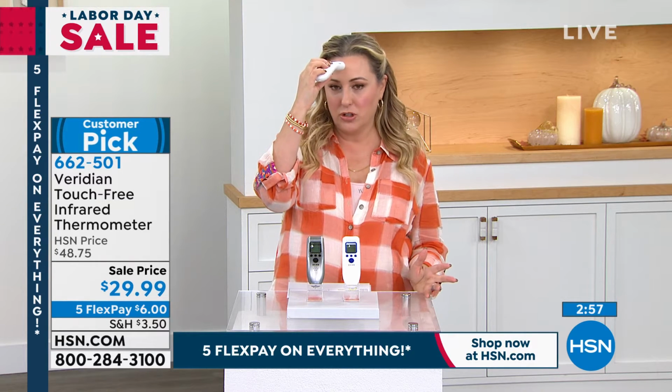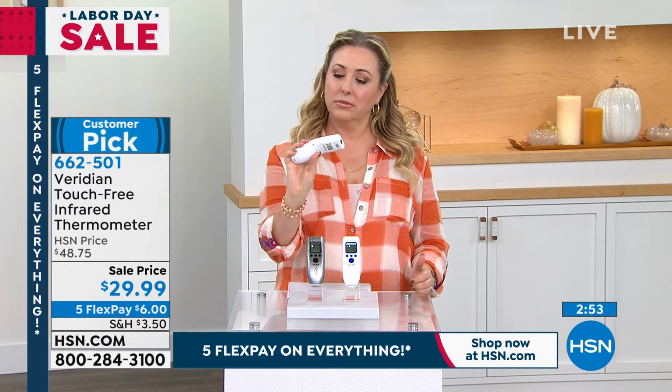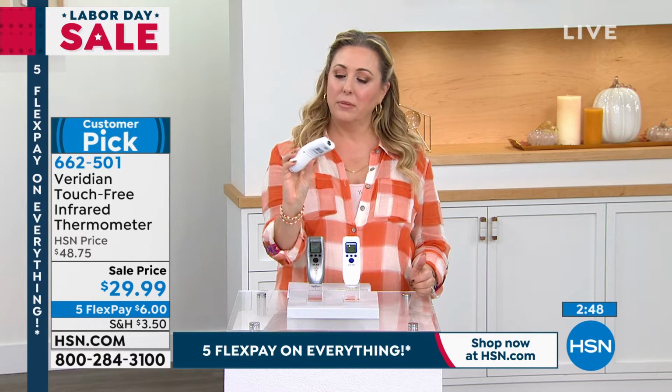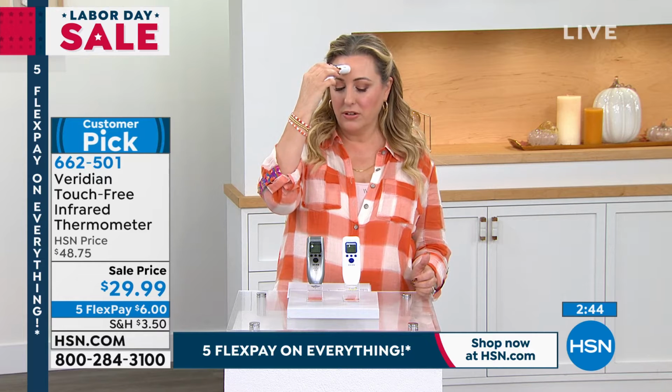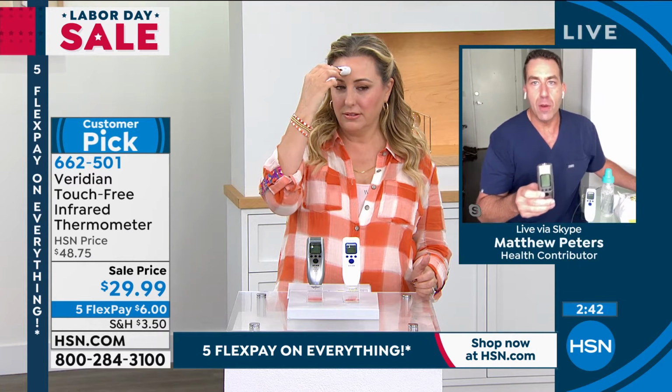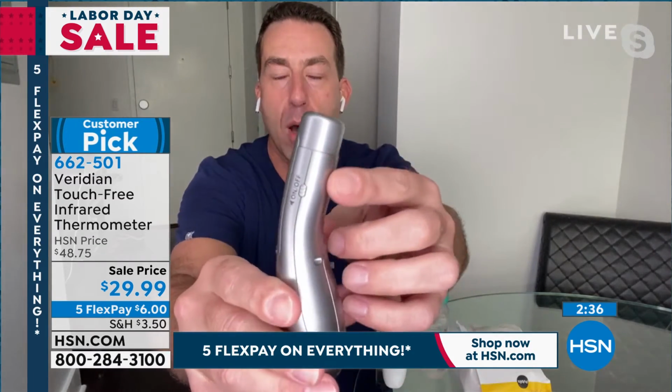And I get my temperature checked every single day when I come to work. Let's see if I did it. You push it and you wait till it goes to low, and then I push it again and then I hold it here. And then, does it beep, Matthew? Because I know I just did it. It does, and the great thing about this is you have the beep, but you can actually shut off the beep. So if you do have somebody there at home that wants to try to fall asleep because they're not feeling well and they have a fever, you can shut that beep off.